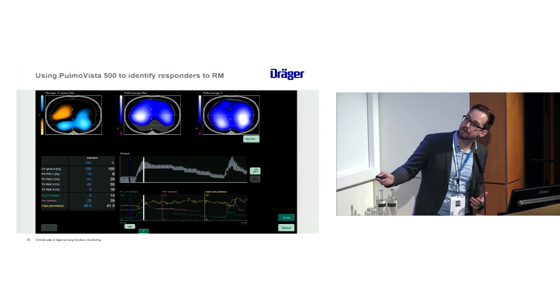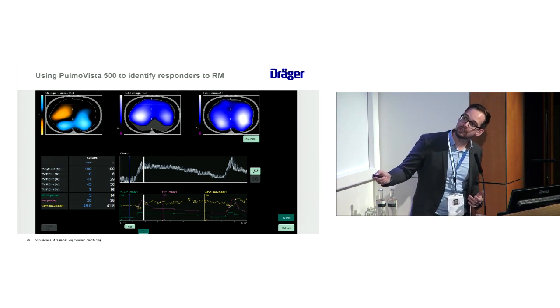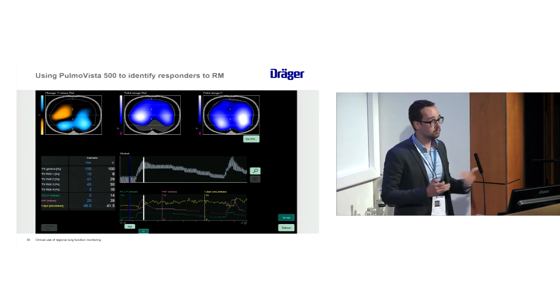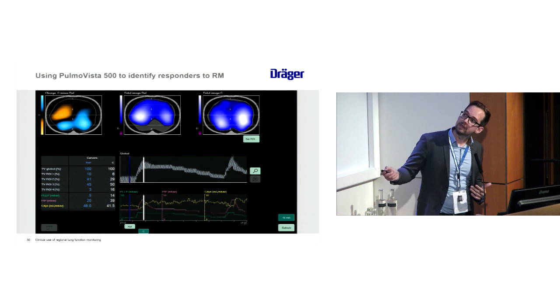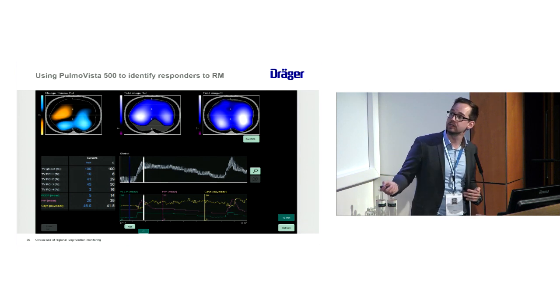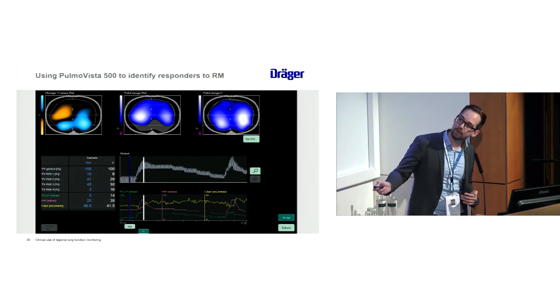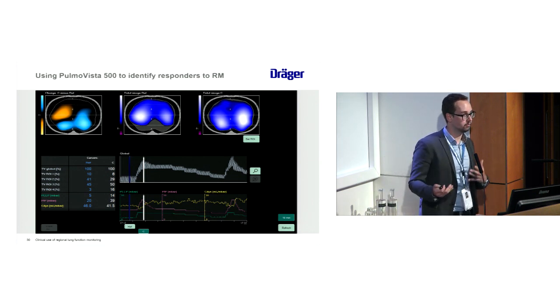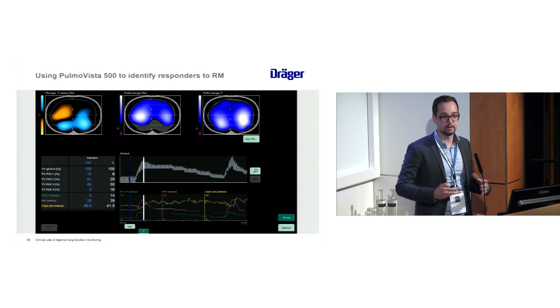So we see every spike is inspiration, expiration, inspiration, expiration. The amplitude is telling us something about the tidal volume going in and out of the patient. However, these steps are reflecting the end expiratory lung volume. So we can actually see, if we look at this graph down here, in green, we can see the applied PEEP, and it has been raised initially and then slowly decreased stepwise. And we can see how the end expiratory lung volume nicely follows the PEEP steps, which is the normal consequence. If you increase PEEP, the lung has to expand.